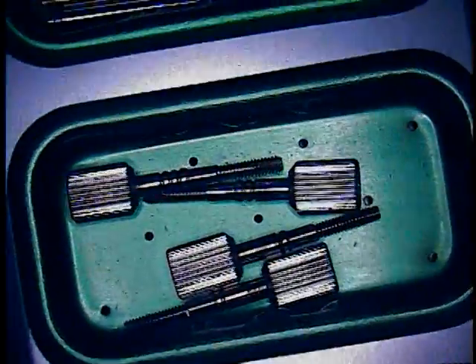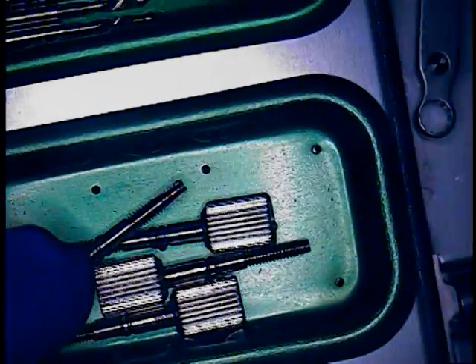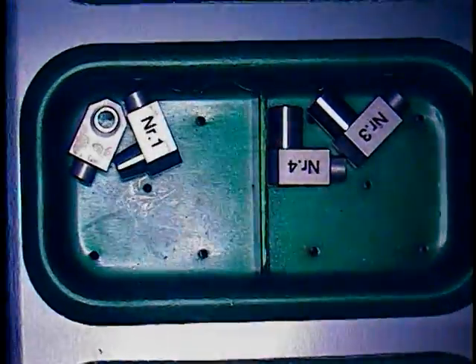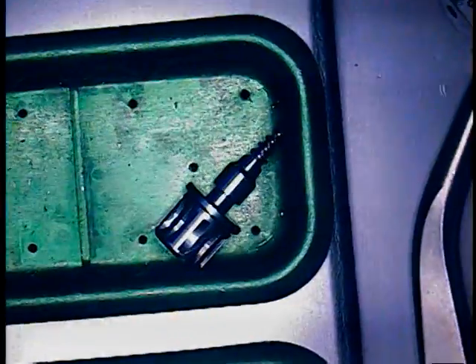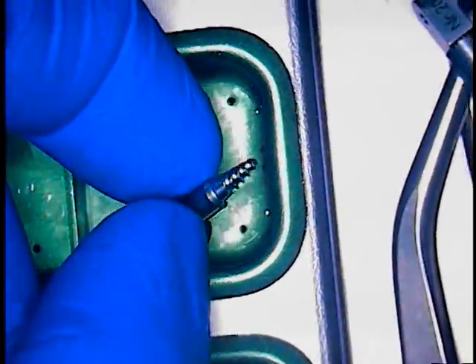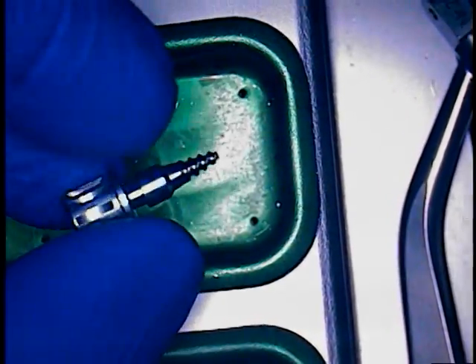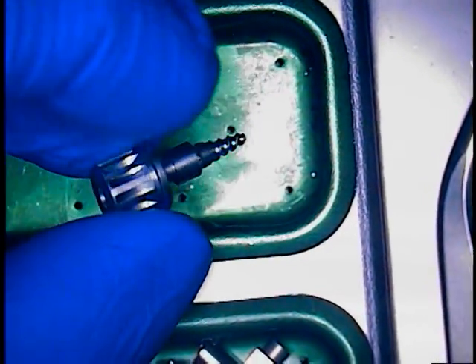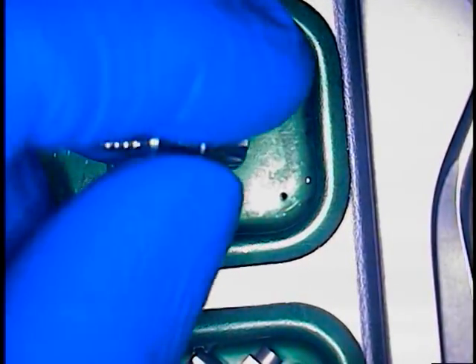These are some of the items you'll see in the kit. There are re-tapping devices — or what they call thread cleaning devices — as well as an assortment of devices to center this, including what looks like a corkscrew-type design: a spiral-shaped instrument to actually remove any loose fragments or anything that might be lodged.